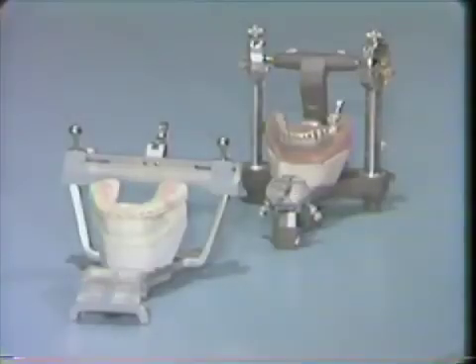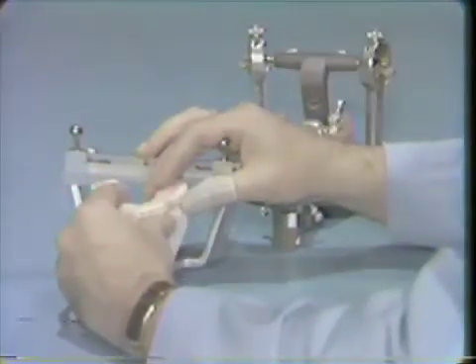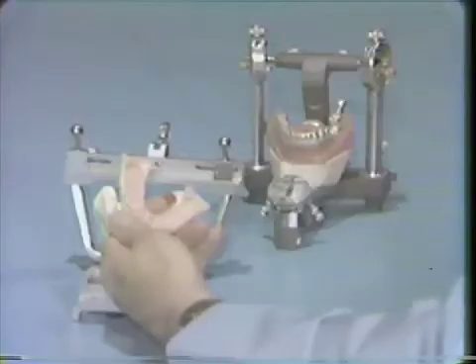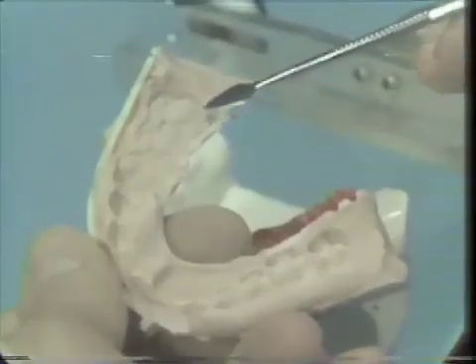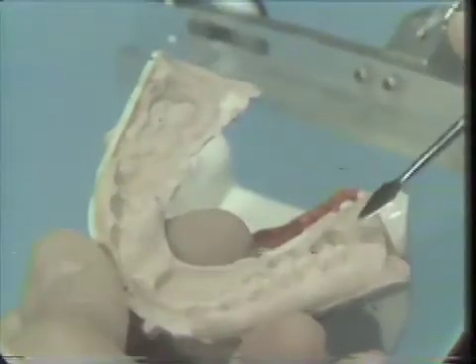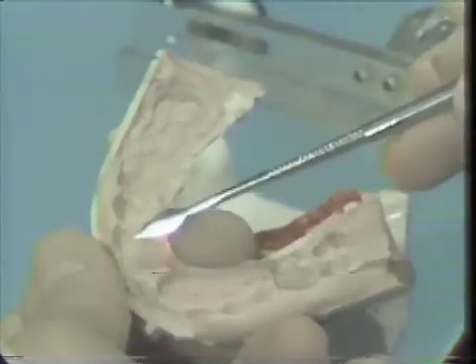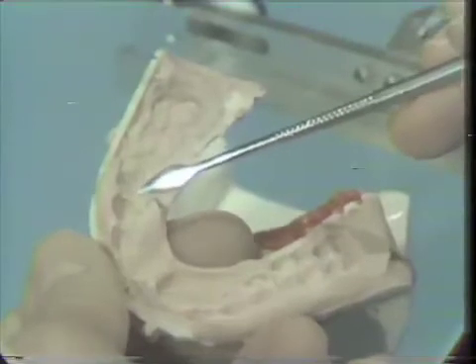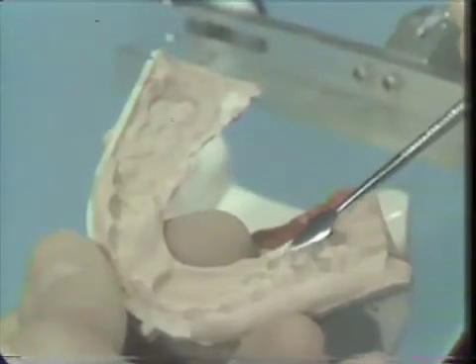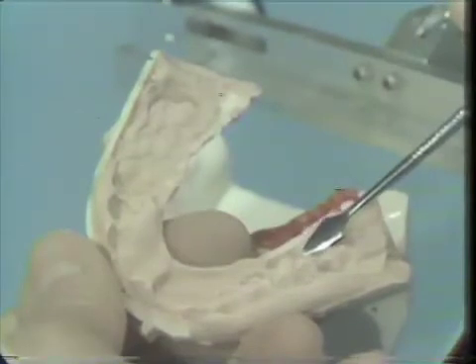Our stone is now set, and we can remove it carefully from the patient's mouth. See that we did not distort it. And here you can see that we have registered our functional chew-in in stone and the balance of the dentition. We have registered more of the occlusal surface on this balance of the dentition than we would normally like to capture. All it's necessary is to have enough of the occlusal surface to allow for us to position the stone key back onto the articulated model without it rocking.